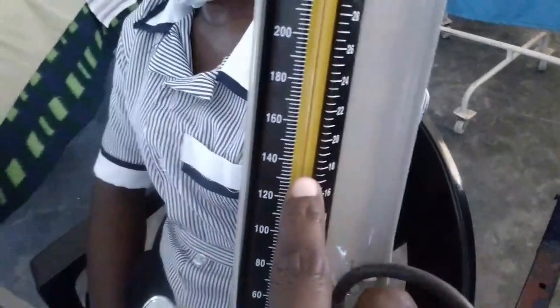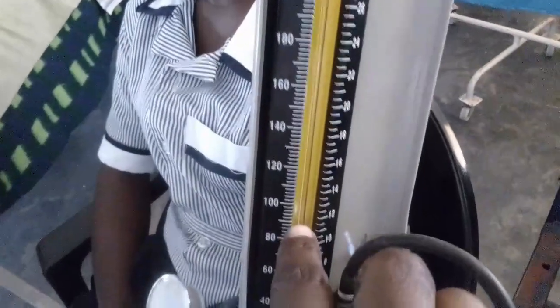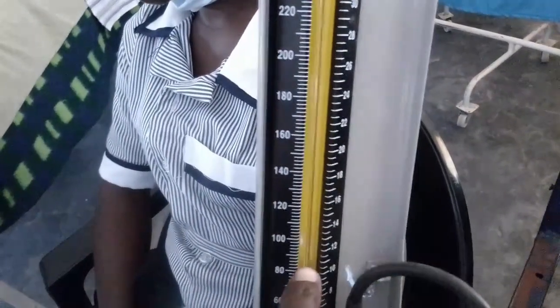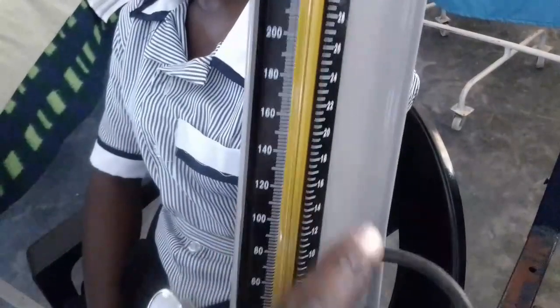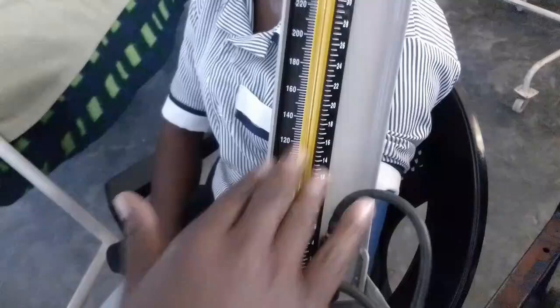So at least the strongest beat was felt around 110 millimeters of mercury. So that has to be the systolic. Then that strong beat began to fade around 90 somewhere there, and the sound reduced drastically at 80, and then here it became quieter. So you can say the blood pressure is 110, which is systolic, over 80, which is diastolic, millimeters of mercury. So you can put it there.